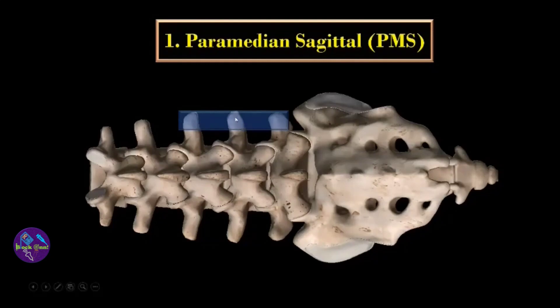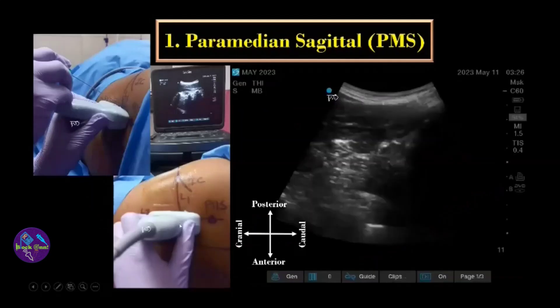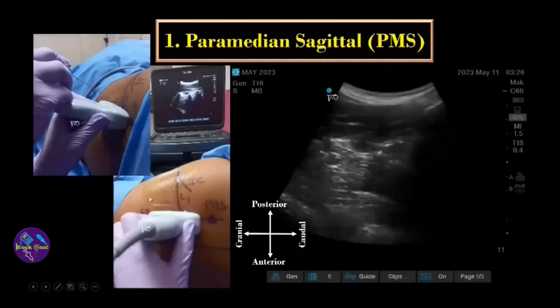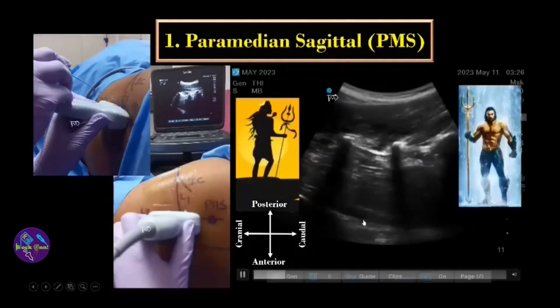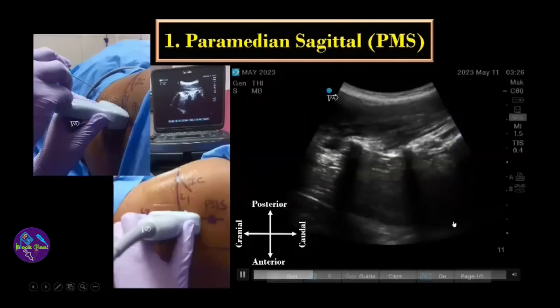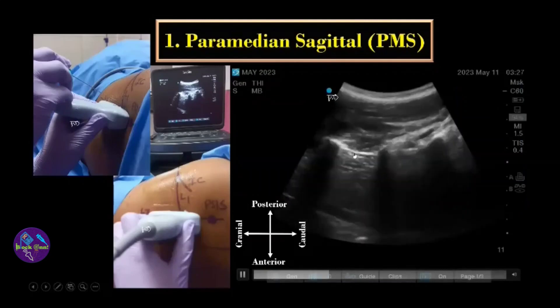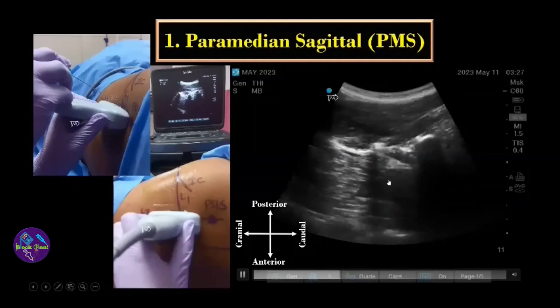Alternatively, you can directly place the probe 3 to 4 cm lateral to the spinous process. Here I have already drawn the landmarks — the same landmarks used during the landmark-guided or PNS-guided block. Your target is to identify the trident sign, then look for the acoustic window in between two transverse processes.